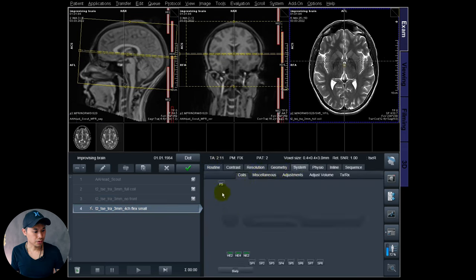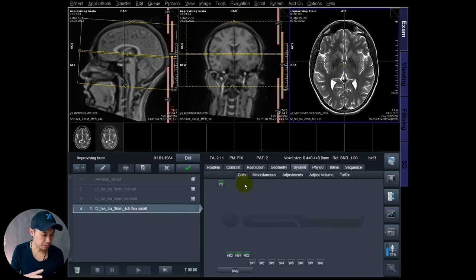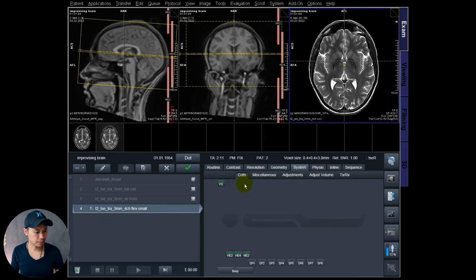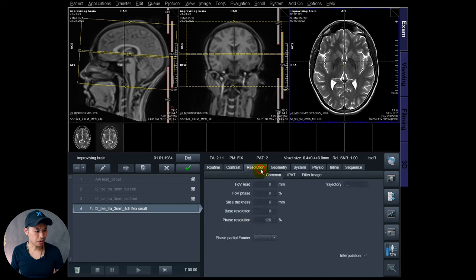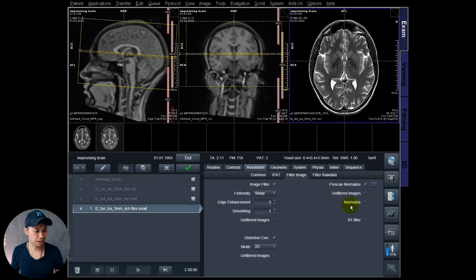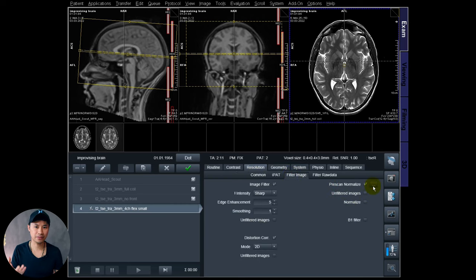Remember to activate the element for the flex coil. One more thing: also check that pre-scan normalize is on — without that you will get very bad images.